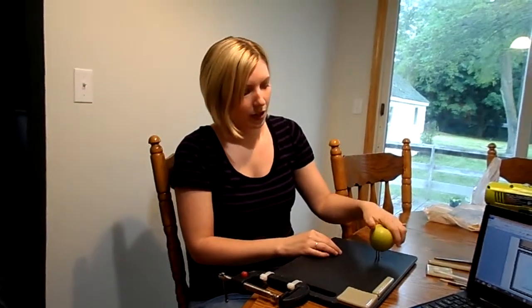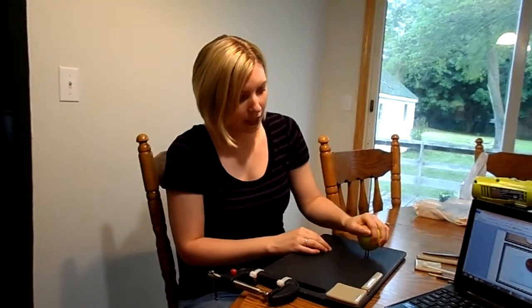So the first thing I'm going to do is take my apple and secure it on the screws. So I just press down firmly, and it's not going to go anywhere because the screws are holding it. And then I would take my peeler with my one hand, whichever one that might be, and I would just go ahead and peel the apple however much I wanted to. Just like that.